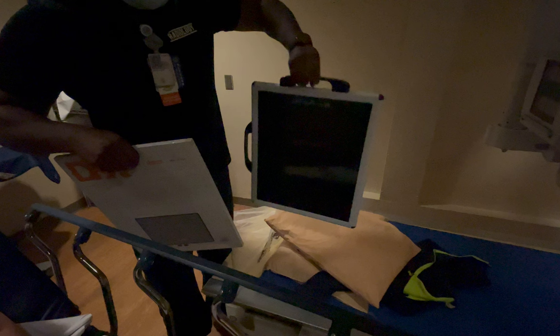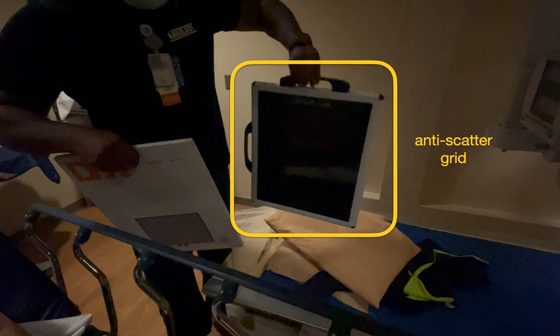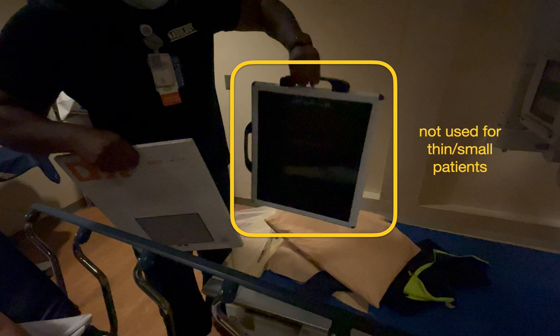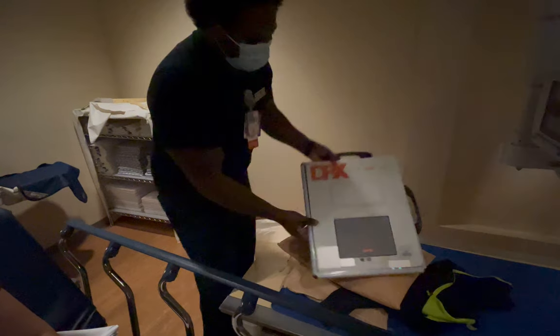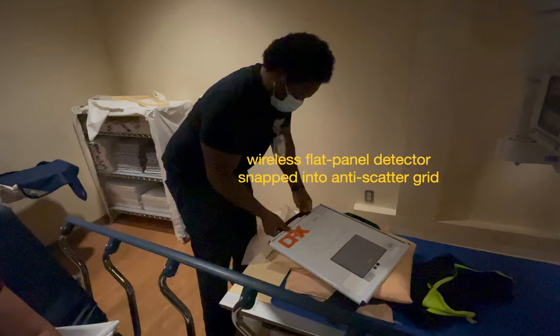The x-ray tech then pulls out the x-ray detector panel, which is the white panel in this image, and the anti-scatter grid, which is the black panel in this image. For thin and small patients the amount of x-ray scatter that occurs is usually much less, and so the anti-scatter grid is not used. For other folks we'll use the anti-scatter grid, which easily snaps together with the x-ray detector panel.